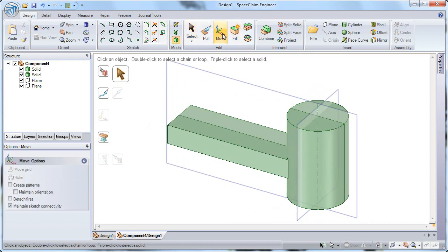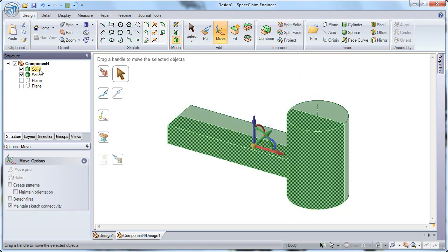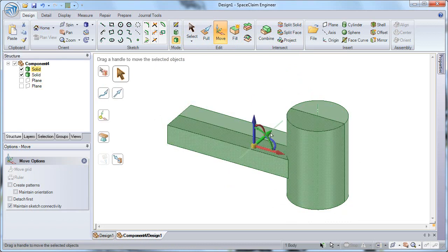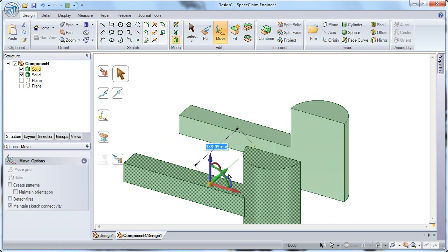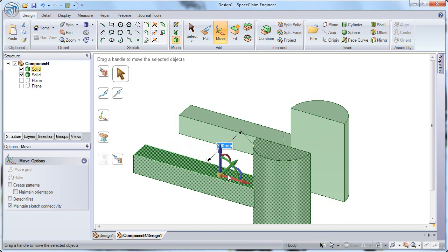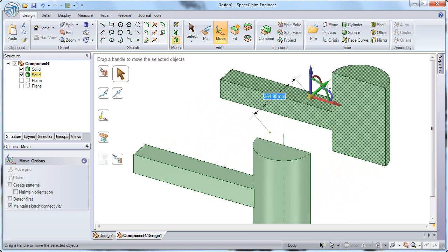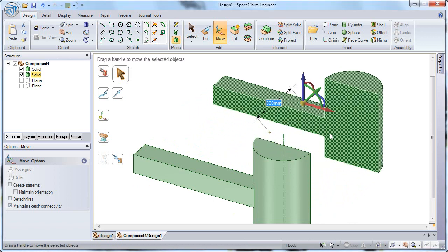I can now move those solids, so let me hide my datum planes, I don't need those anymore. And I'll select on the first solid, move that by dragging along the green arrow. We'll specify a movement of 300 millimeters. And we'll move our second solid, selecting it in the structure tree, and move it along the green arrow the same distance. So we've created some space in between our two solids.